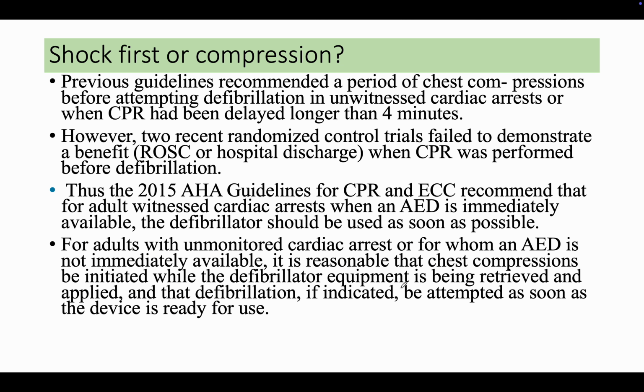So previously there was a dilemma whether to give the shock first or the compression first in a patient with VT and VF. But current guidelines say that if a defibrillator is available, the defibrillator should always be used first before the cardiac compressions, which will lead to good, successful defibrillation.